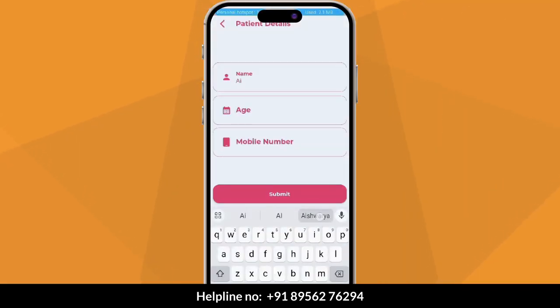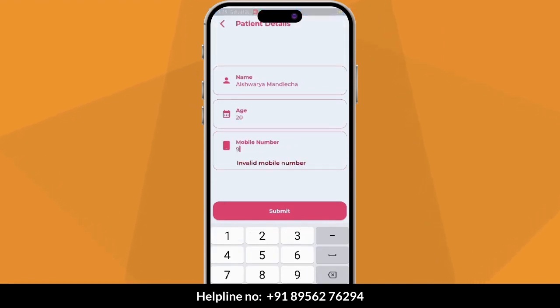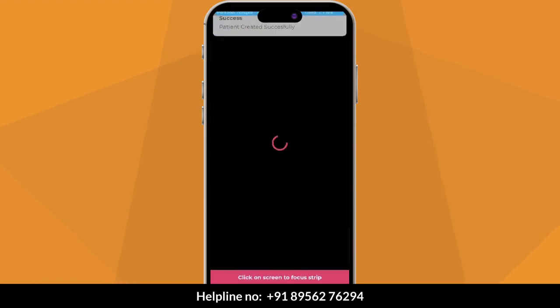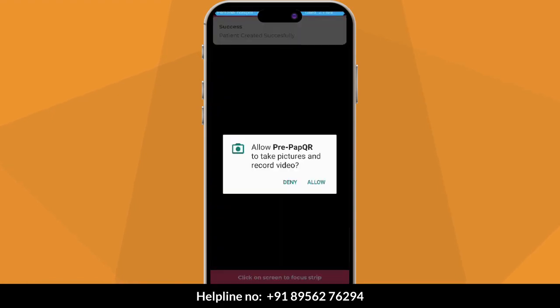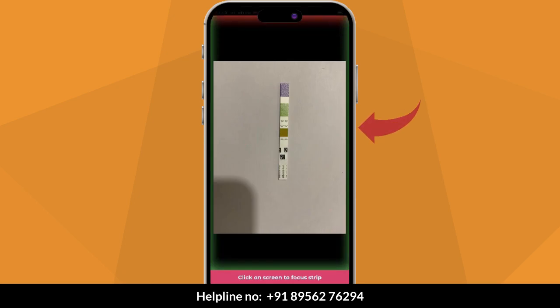Click on Start Screening. Enter patient details: name, age, and phone number. The camera will open — make sure you hold the camera properly. All sides of the bounding box should be green in color.